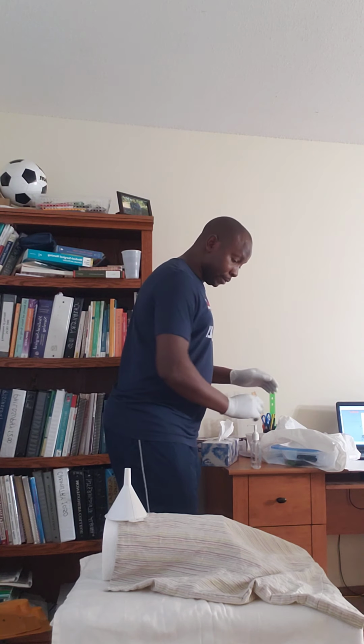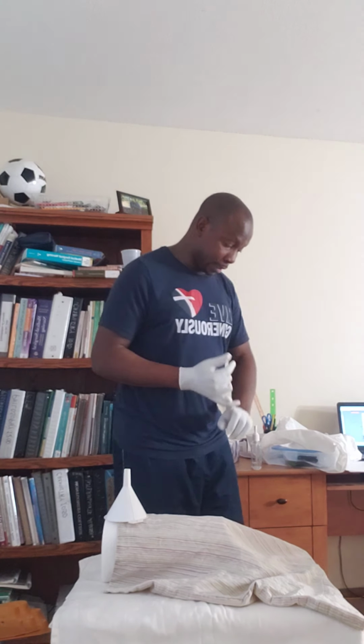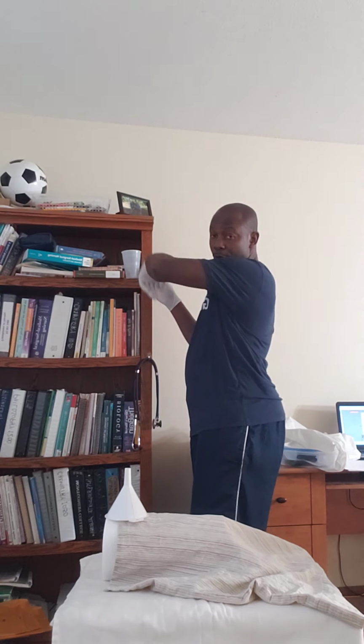After that, I'm going to prepare the patient kit. There are two kits I'm going to use, but I'm going to start with the patient kit. In the patient kit there is normal saline. But why did I put these gloves on? I put these gloves on to position and comfort my patient, and to make sure the tracheostomy is in a good position, and so I can touch the suction canister where everything will be going. I have to use these because there is fluid, and that is why I have PPE on.